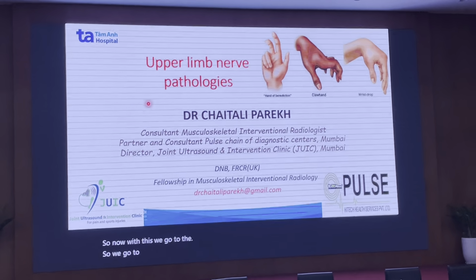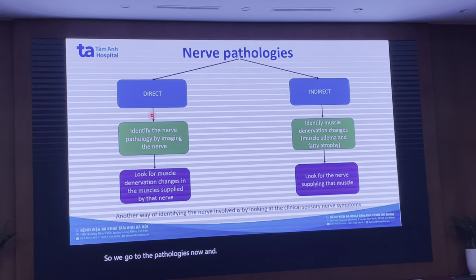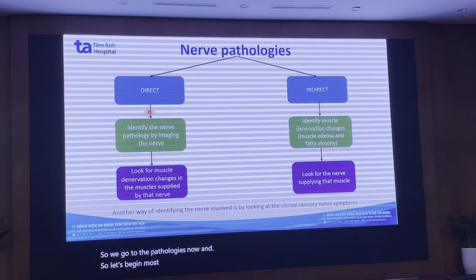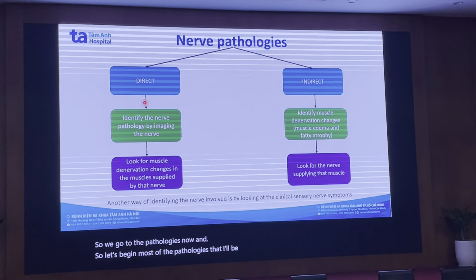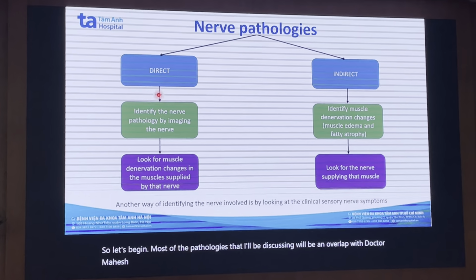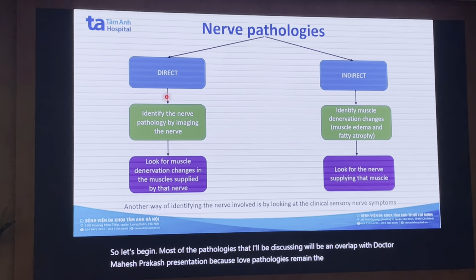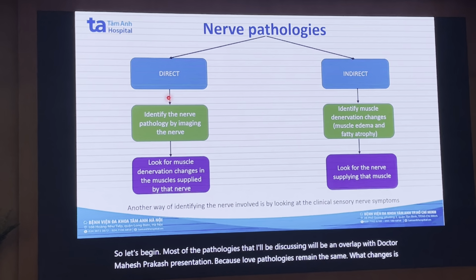Pathologies now, and so let's begin. Most of the pathologies that I'll be discussing will be an overlap with Dr. Mahesh Prakash sir's presentation, because nerve pathologies remain the same. What changes is the site of entrapments, right?